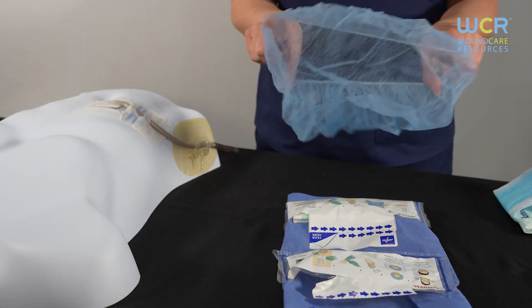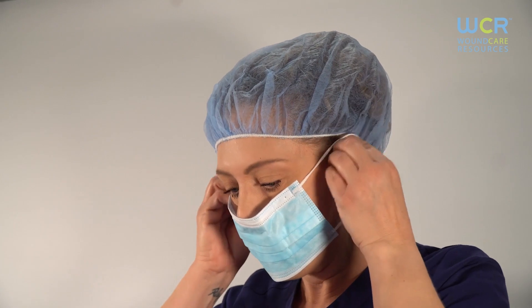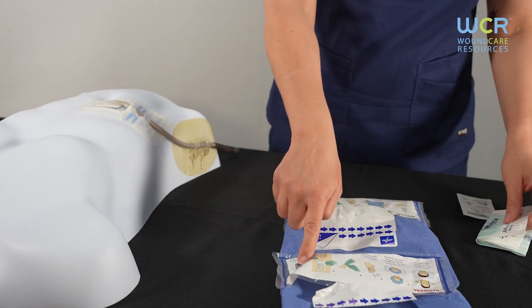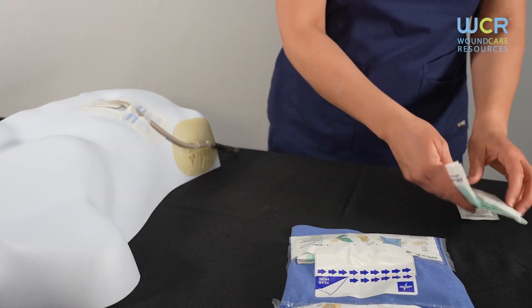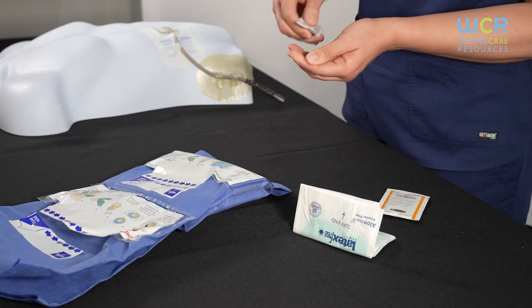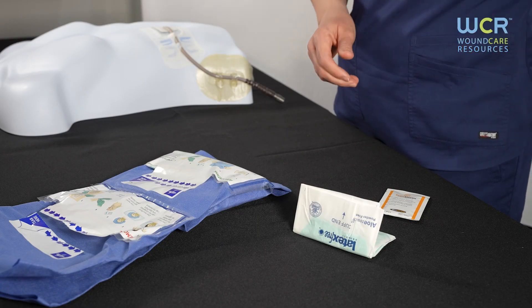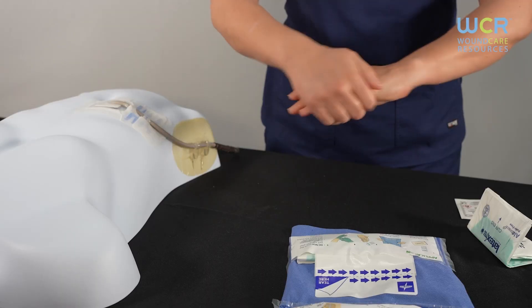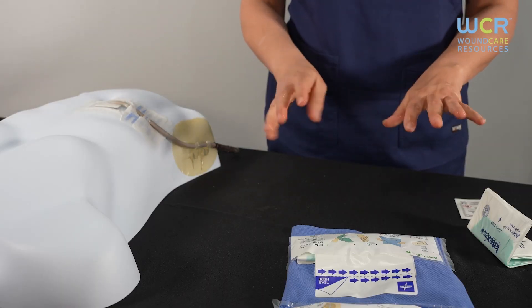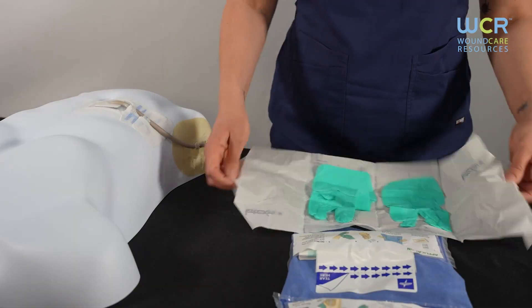Place a cap and a mask on yourself, the patient, and any other people in the room. Follow the instructions as listed in the artwork on the pocket, starting with cleansing your hands with hand sanitizer and allowing it to dry completely before applying your clean gloves.